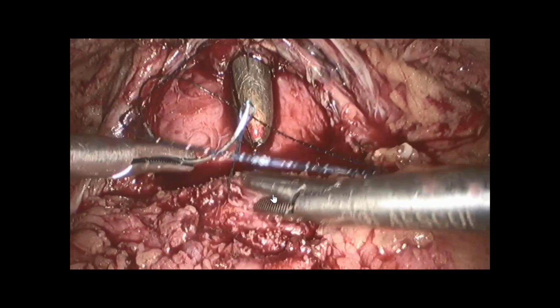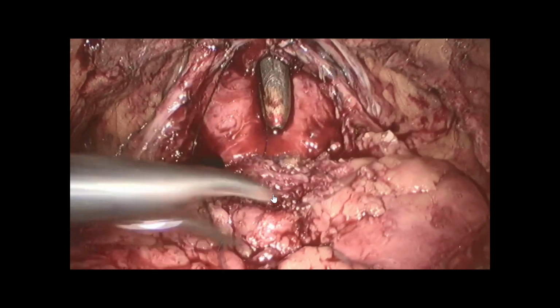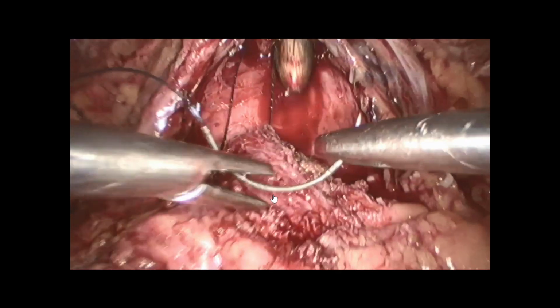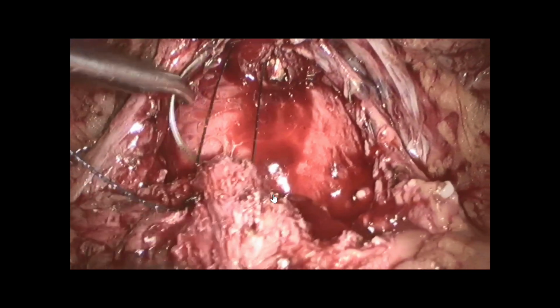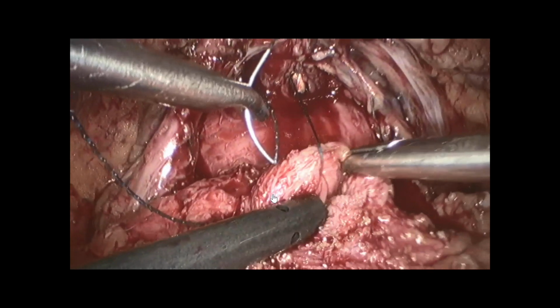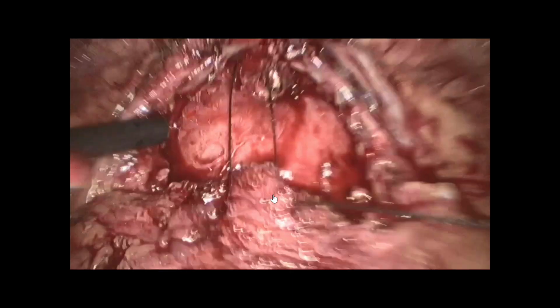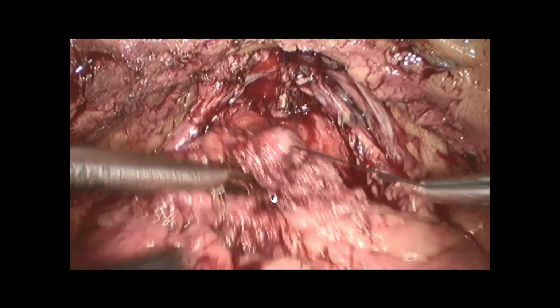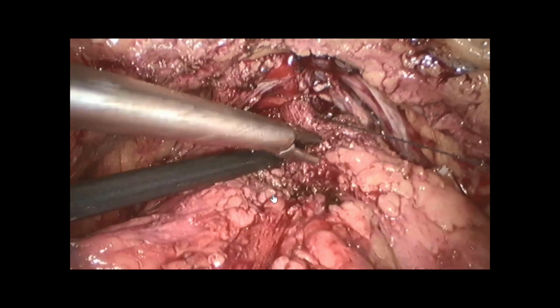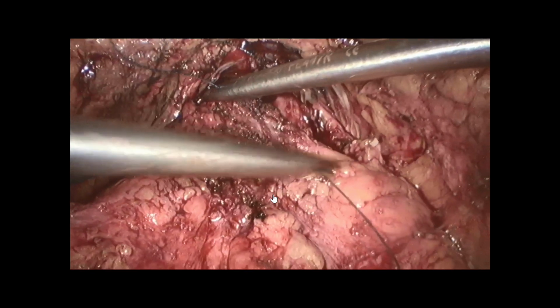And because I'm left-handed, I start at 9 o'clock, but if you are right-handed, you will start at 3 o'clock, okay? And what is the most important is to start to do a perfect posterior layer, because all the leaks are posterior. And when you have a leak posteriorly, then you have fibrosis, then you have incontinence, okay? So do a perfect anastomosis posteriorly.